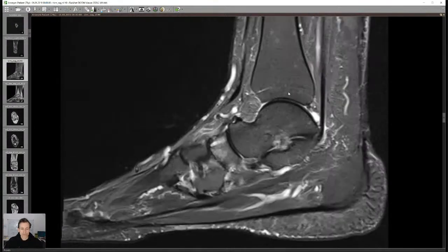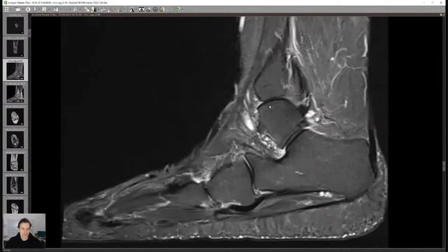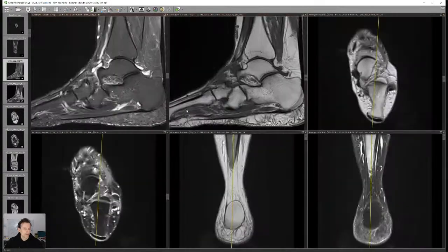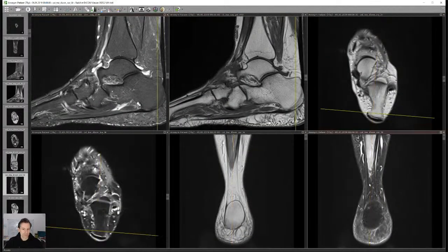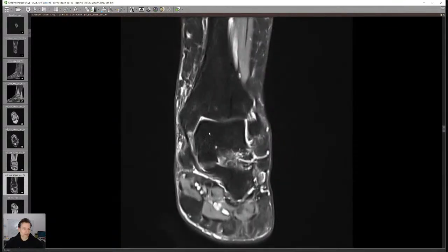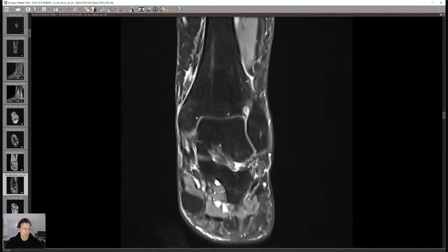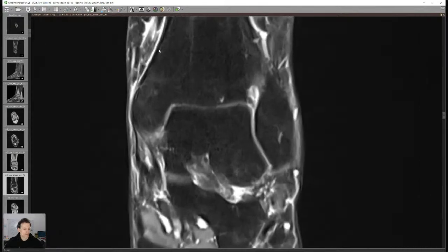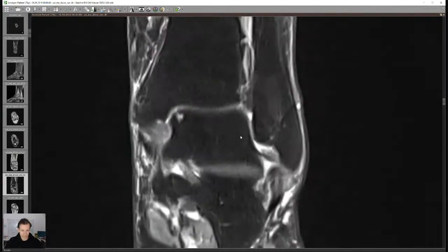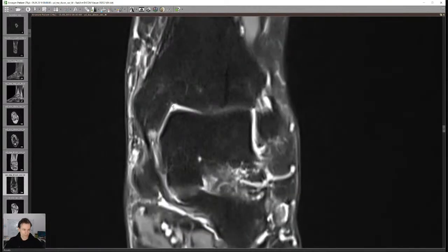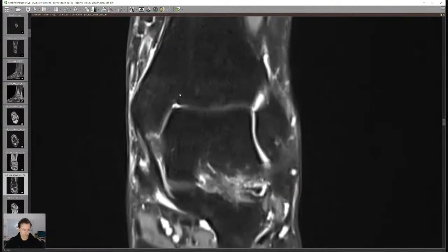Starting with the bone, the ankle joint here is not too bad — we don't see any bone marrow edema. It's worth having a look at a coronal view as well to check for osteochondral defects, especially on the medial and lateral talar shoulders.